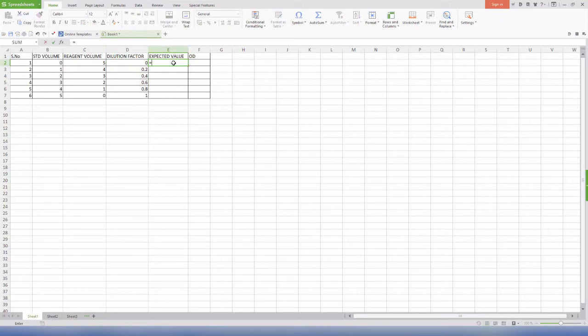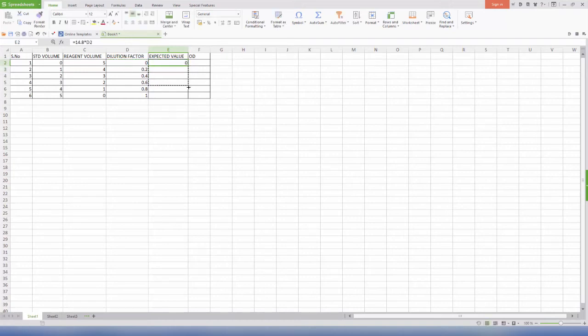For column E, that is concentration, feed in the formula which is 14.8 multiplied by D2. Enter, select the formulated cells, and drag down.